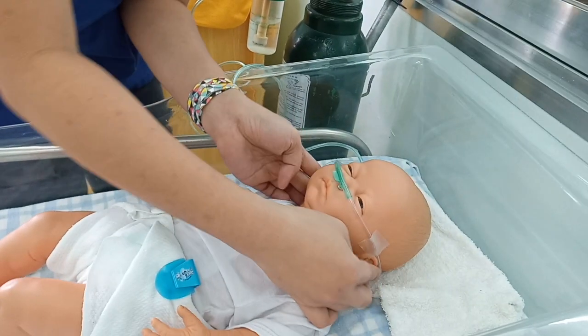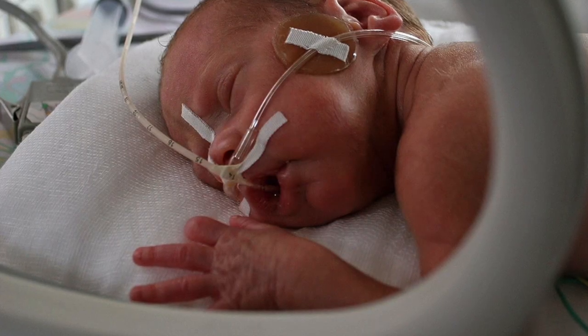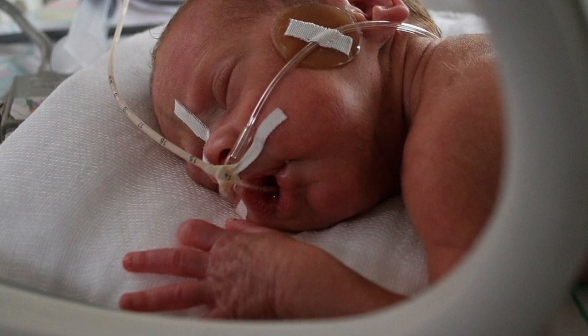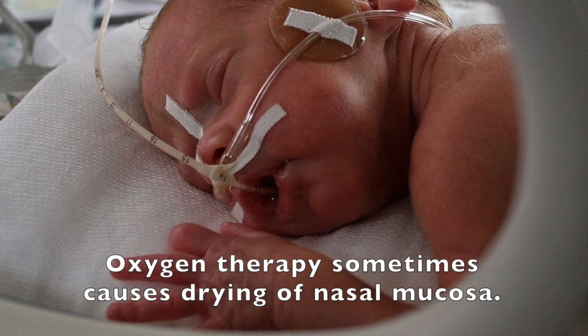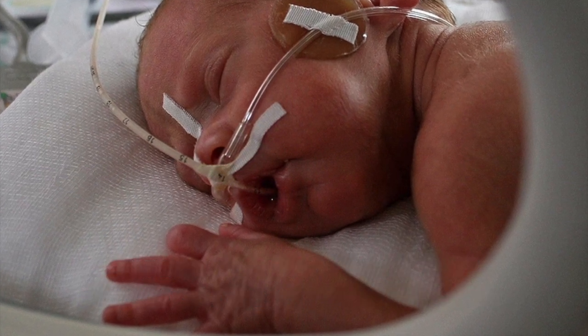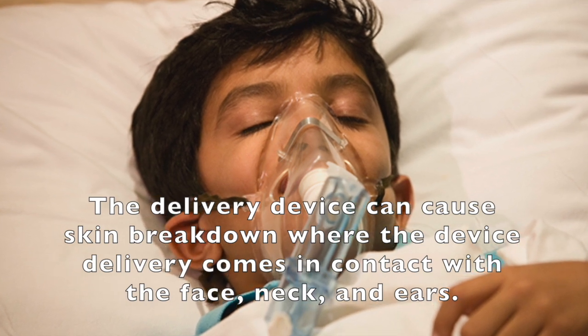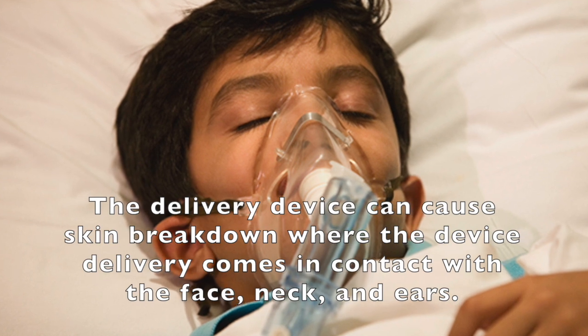Observe patient's external ears, bridge of nose, nares, and nasal mucous membranes for evidence of skin breakdown. Oxygen therapy sometimes causes drying of nasal mucosa. The delivery device can cause skin breakdown where the device comes in contact with the face, neck, and ears.